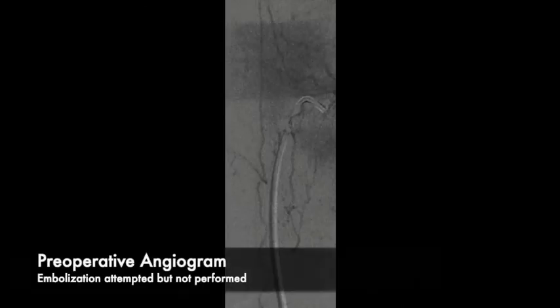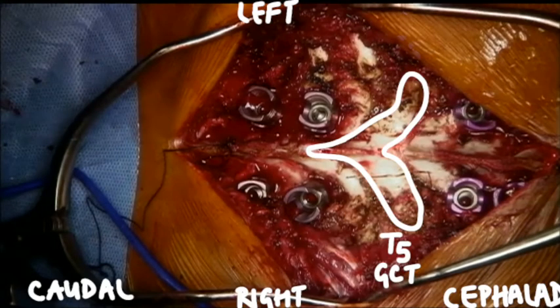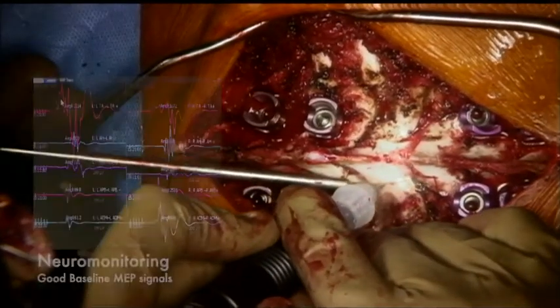Preoperative embolization of segmentals was attempted but could not be performed successfully without compromising the vascularity of the spinal cord. For orientation, on the right side of the screen is the head end and right in the middle is T5, which contains the tumor.